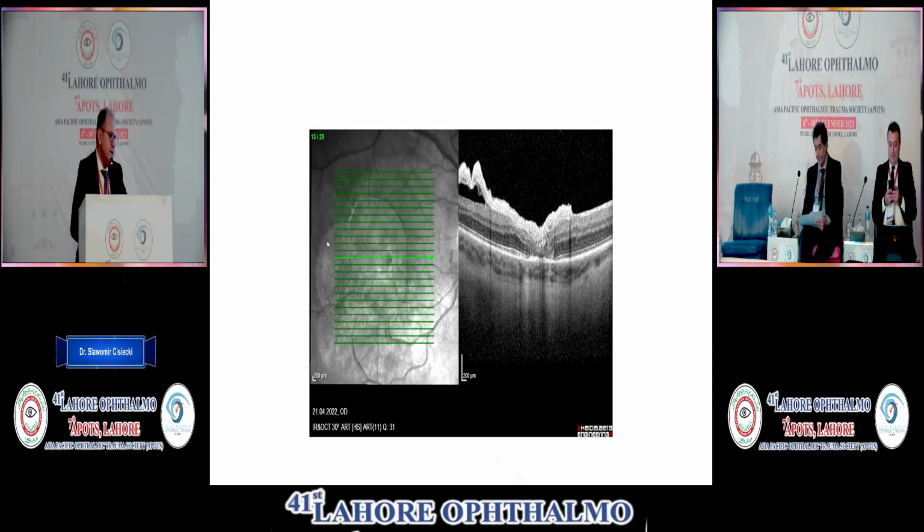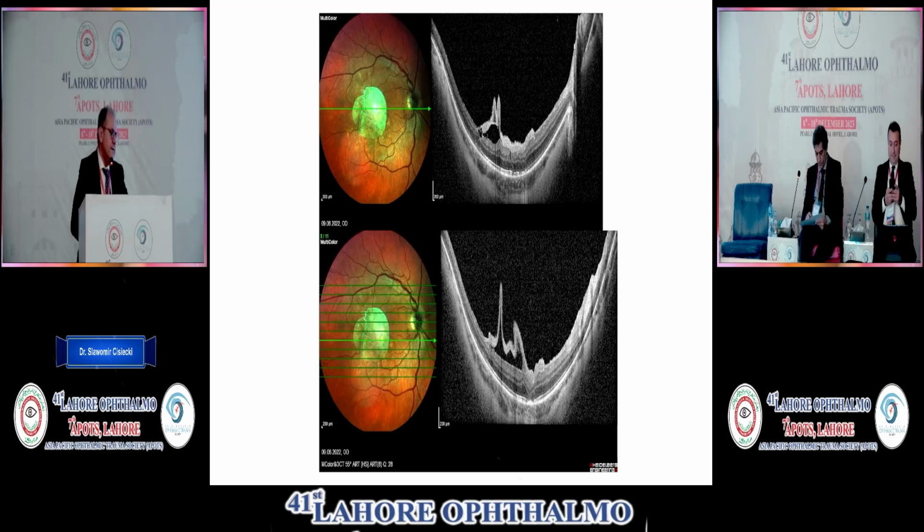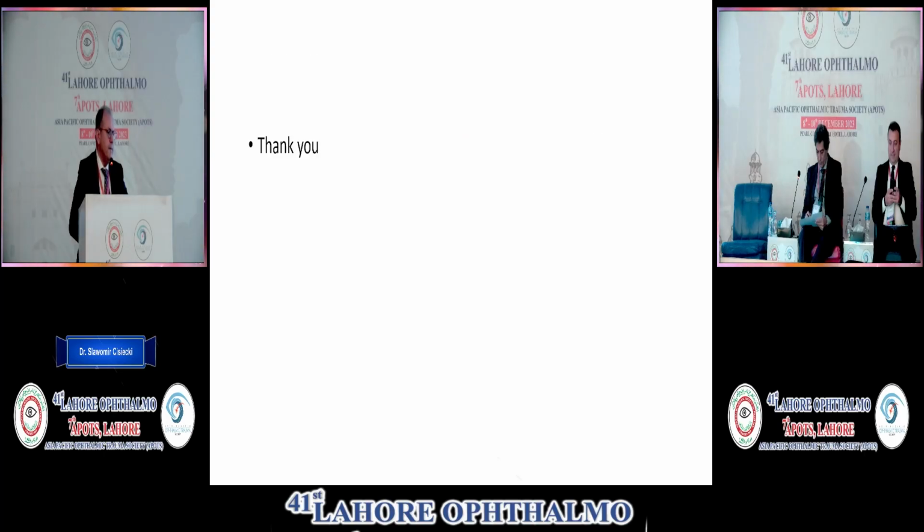And this is the patient 2 years after the operation, and the amniotic membrane is still over the hole, with improvement of vision from hand movement to 0.2. Thank you very much.